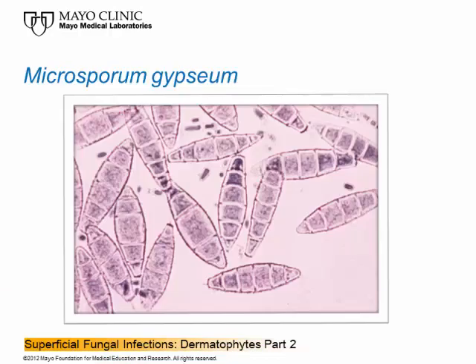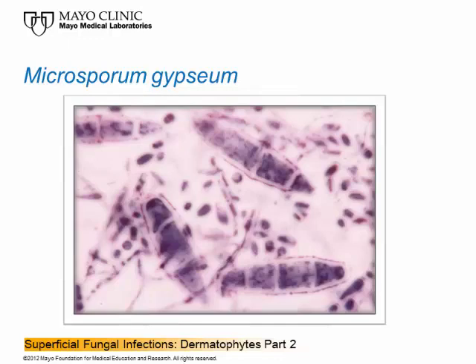The slide shows Microsporum gypseum macroconidia, and you can see the rough wall if you look closely. At the end of the macroconidium in the center bottom of the slide, on the left-hand side you can see where it was attached to a hyphal strand, and looking at the opposite end you see that it's rounded — a characteristic of Microsporum gypseum. Often the center cell grows a little faster than the others and appears larger. The macroconidia are multi-celled, rough-walled, and rounded on the end.